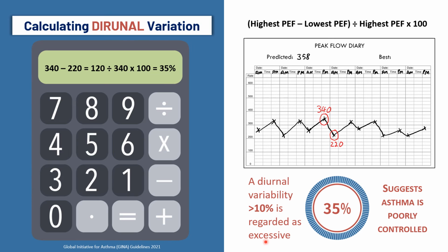The thing as well that I'm going to tell you about this now is this: your patient has got to do this accurately, and you've got to get that message across. So when you ask a patient to do one of these diaries, you've got to back it up and say, listen, I'm asking you to do this because I need a bigger picture of how well controlled your asthma is.